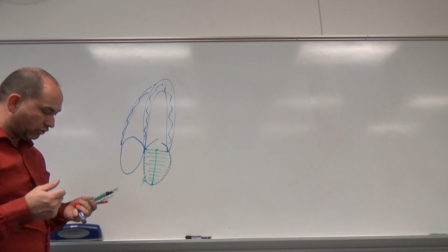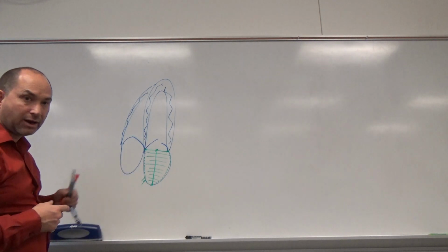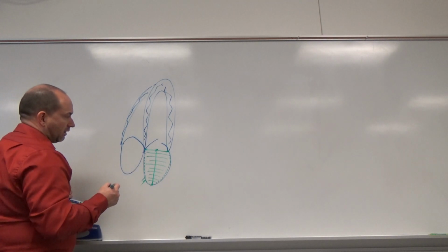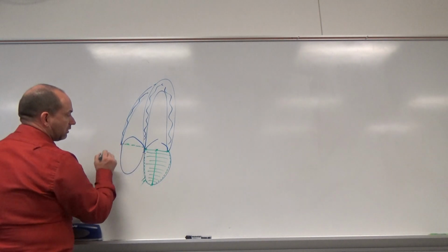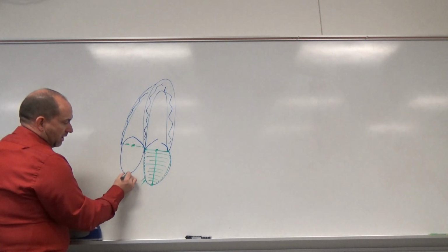The other way I'm going to teach you, just because some labs might still do it this way. I would normally do the same thing on the right atria, and I'm going to do this in 4-chamber and 2-chamber. The other way that's done is called the major and minor axes. So I'm going to draw an imaginary line across the annulus, and I'm going to set a caliper there at the maximum distance.